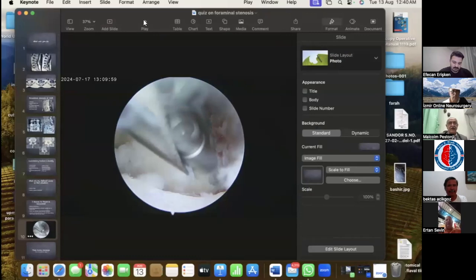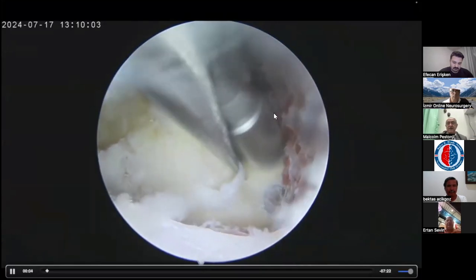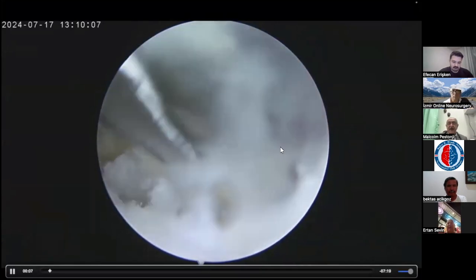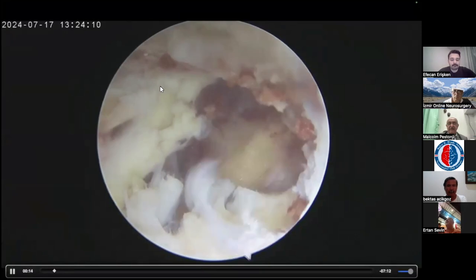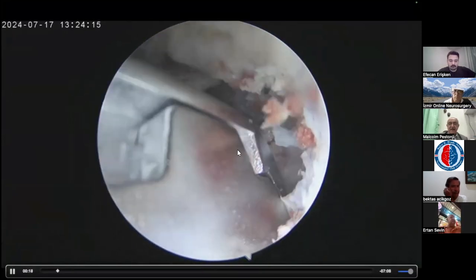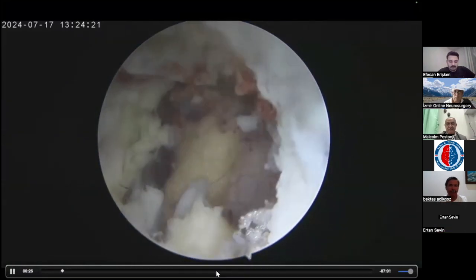So I will just play this video. You can see how the flaval separation zone develops. This is burring underneath the lamina and slowly the flavum is separating out. This is my facet, my side of the facet. Now I'm doing a flavectomy on both sides. This is the midline. I'm cutting flavum on my side and on the opposite side. So I'm carrying out a proper decompression first.